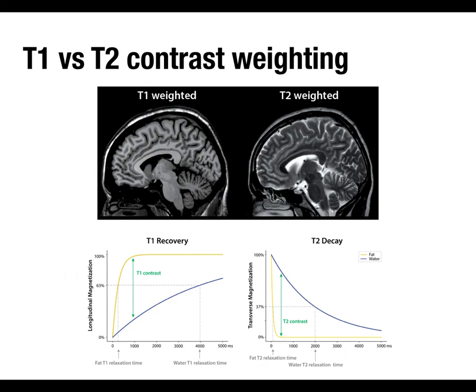In typical functional cognitive neuroscience imaging, T1 weighted images are quite common because we want a nice looking structural image of our individual's brain. And then the fMRI images aren't using either of these. It's another contrast we'll talk about later. The T2 weighted images are not used a lot, certainly not in functional imaging, and not a lot even in most cognitive neuroscience structural imaging. They are used quite a bit clinically because having these different weightings can show you different things.